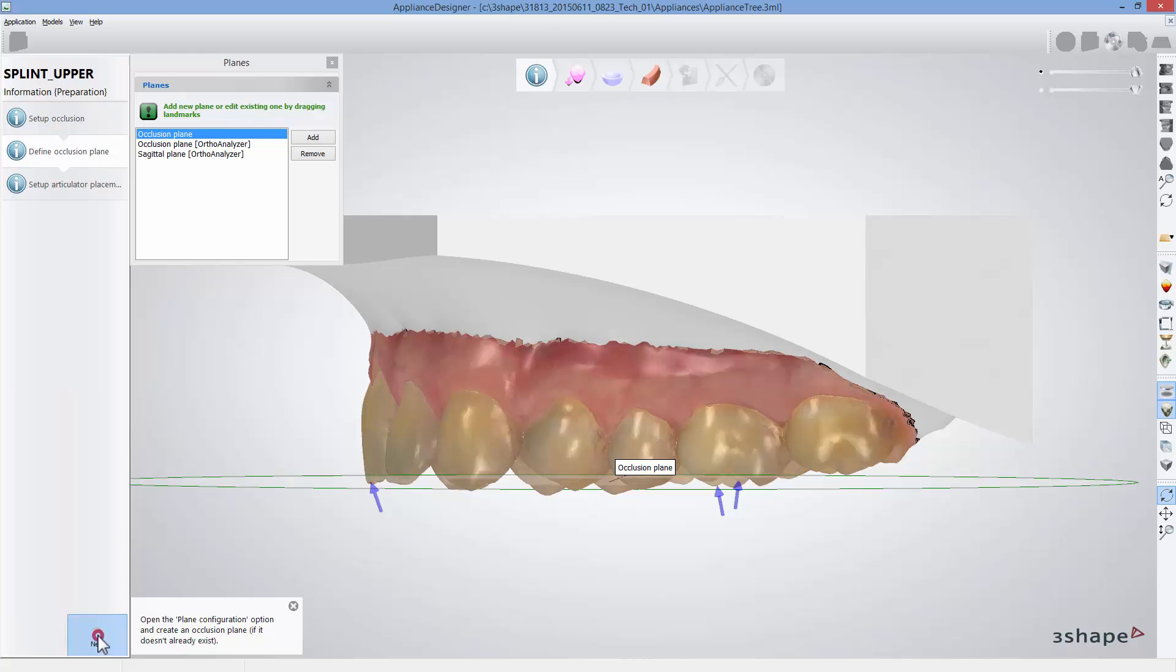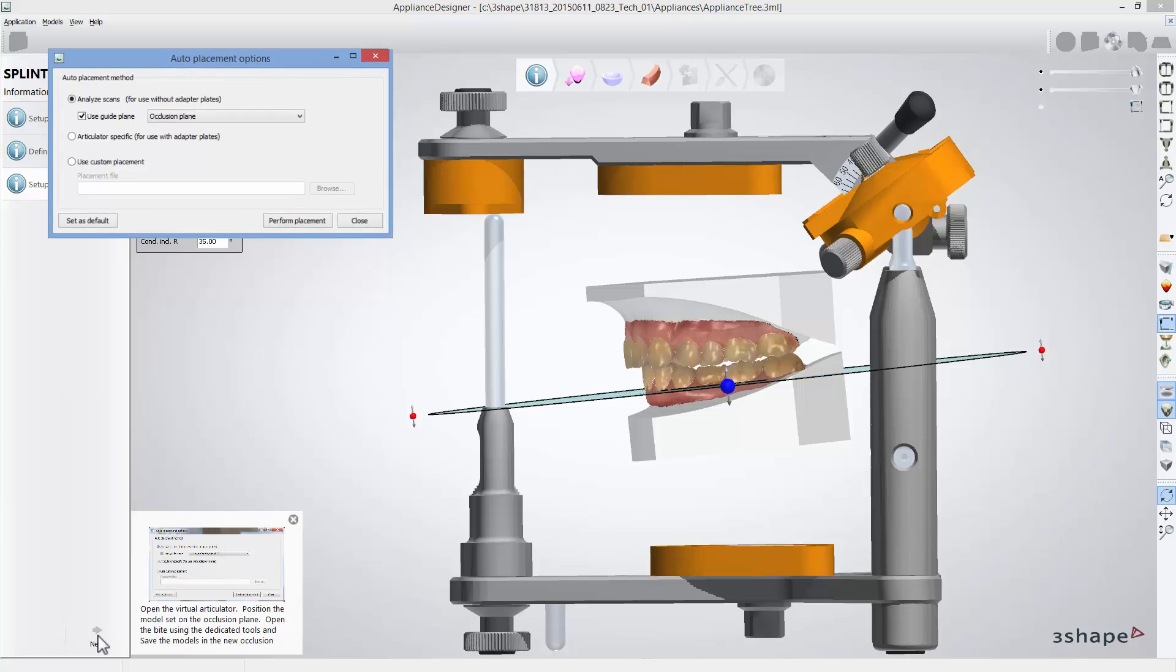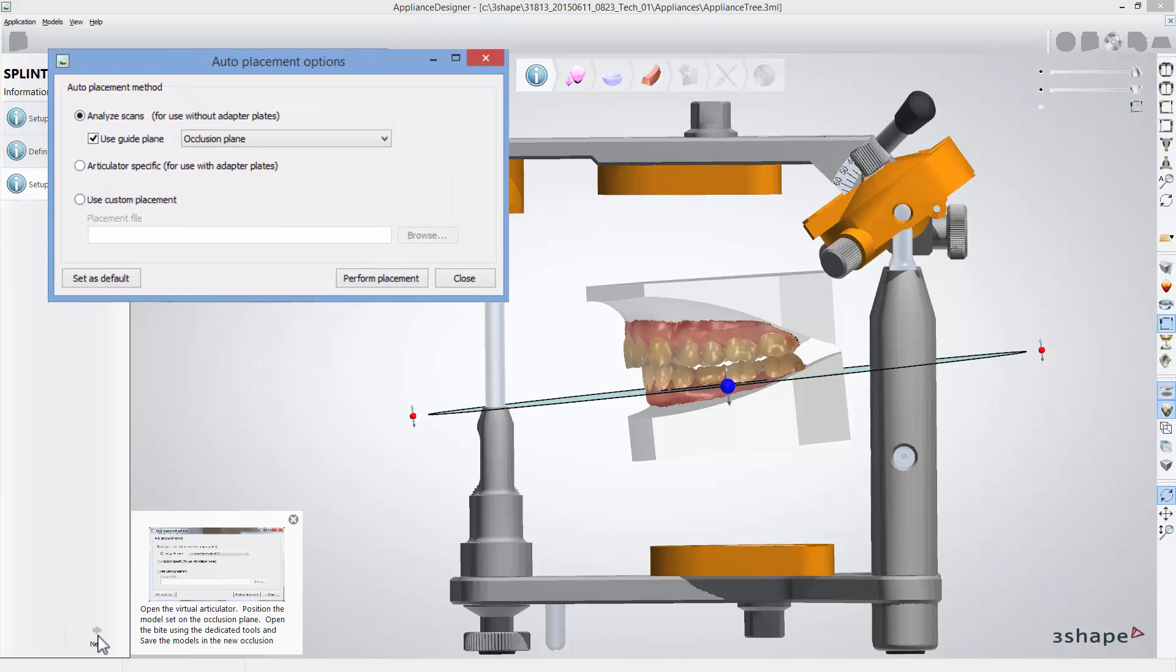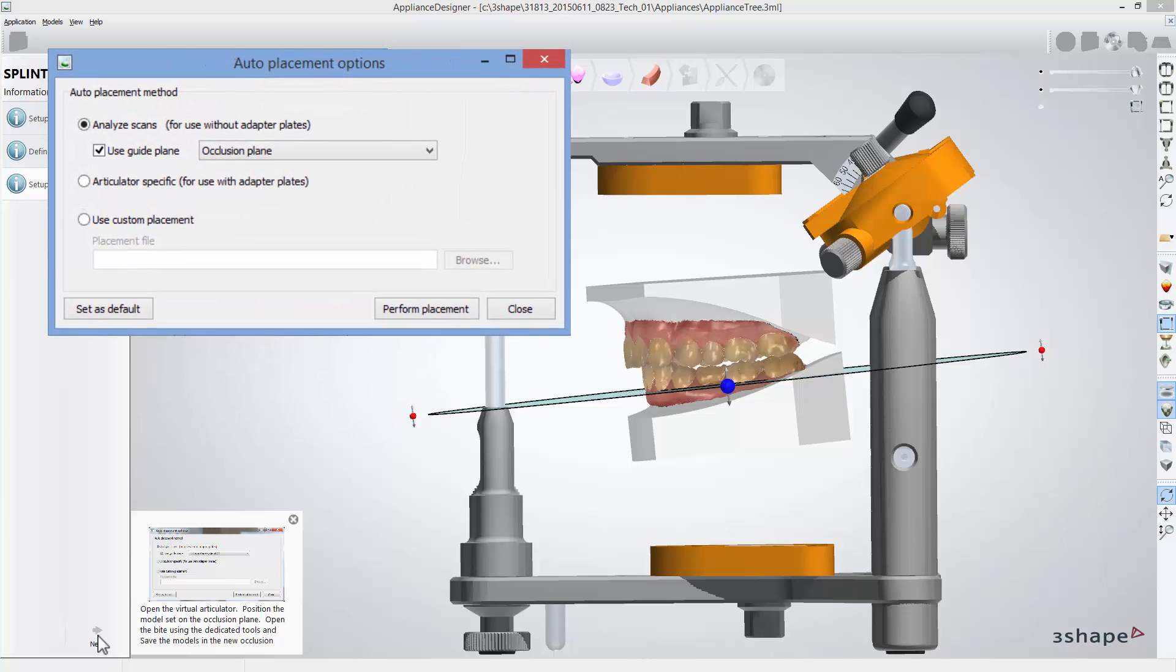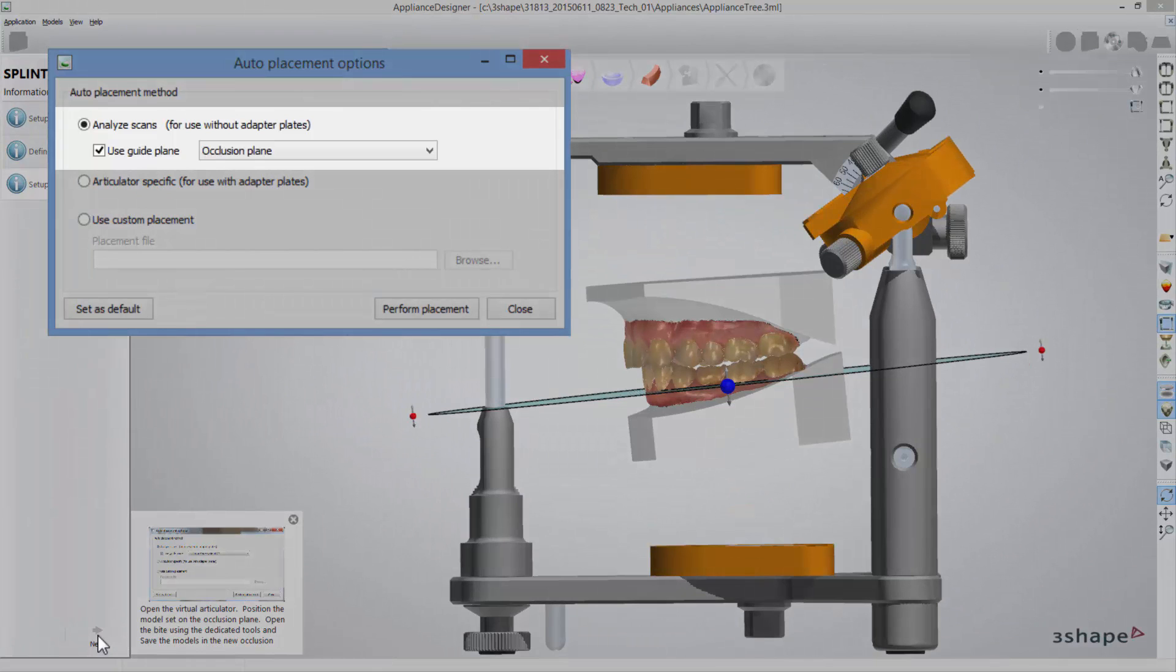Now click next to get to the scan articulator placement step to set models according to one of the occlusal planes. Analyze scans auto placement method is marked as default as well as use guide plane.